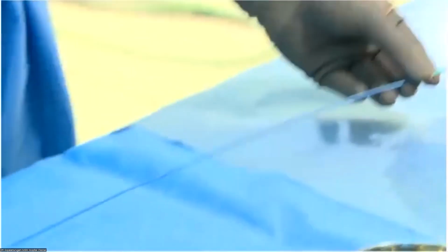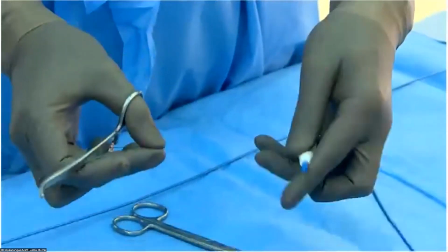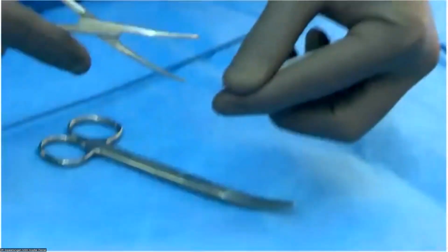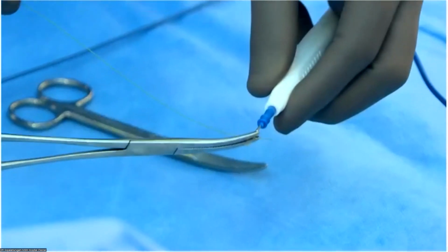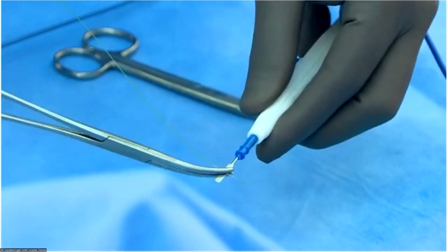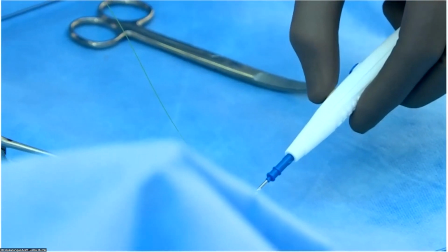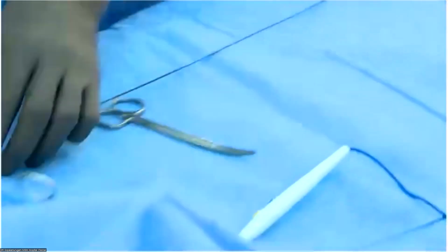And to the other end, you can see here the end of the wire, the Astato wire. This is the end of the Astato wire. You can see here that's connected onto the Bovie and then clipped on. Yeah, I hope that is very, very clear, and that's ready. And once we press the button to diathermy the end of the wire, it'll get charged and it'll go through tissue. And I want you to come back here, and I hope you can see here the charge system.